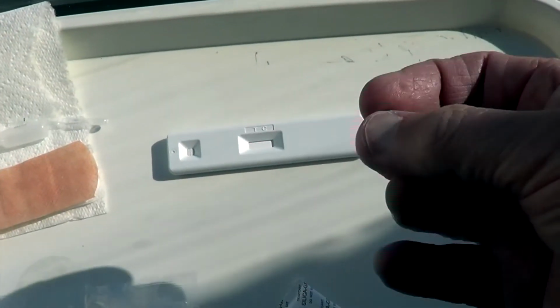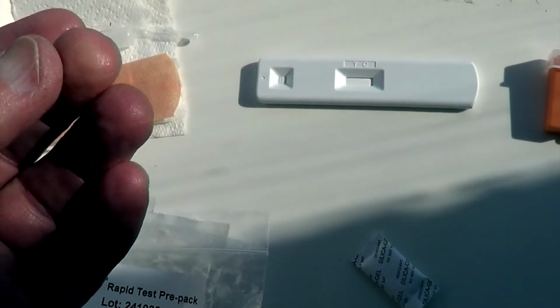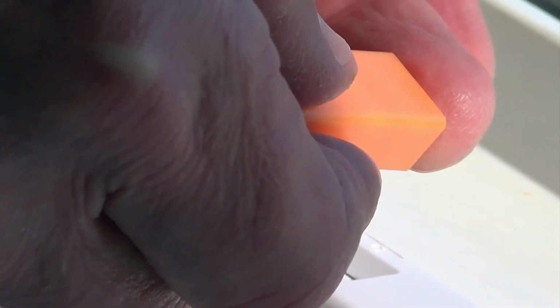I'll wash my hands first, use my left hand, so I can use my right hand to do all the jabbing. Okay, nice warm water to wash my hands first. Okay, so let's take the little lancet, take the top off. There's a needle inside there, so I just need to press the needle on the side of my finger until it goes ouch. Until it goes ouch, okay?